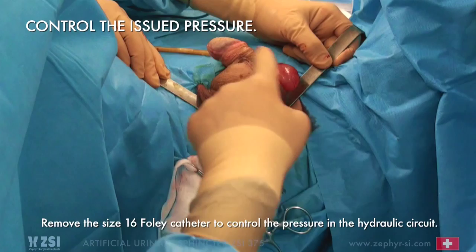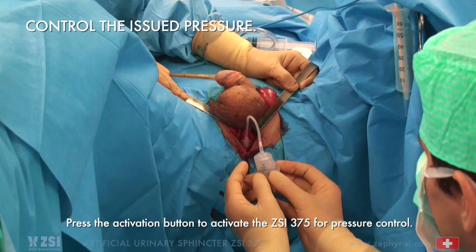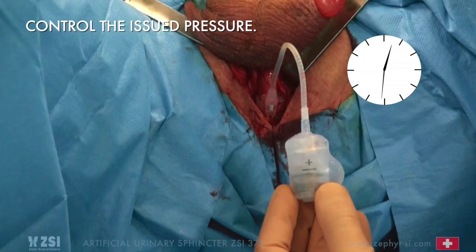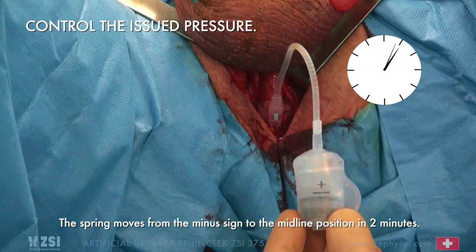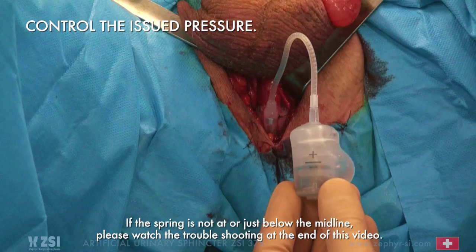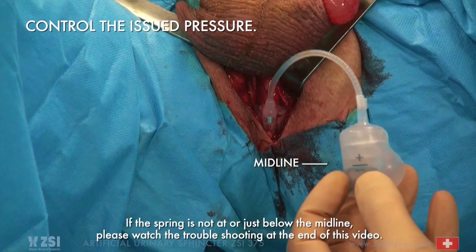Control the issued pressure. Remove the size 16 Foley catheter to control the pressure in the hydraulic circuit. Press the activation button to activate the ZSI-375 for pressure control. Wait 120 seconds for balance until the spring arrives at the midline — the spring moves from the minus sign to the midline position in 2 minutes. If the spring is not at or just below the midline, please watch the troubleshooting at the end of this video.